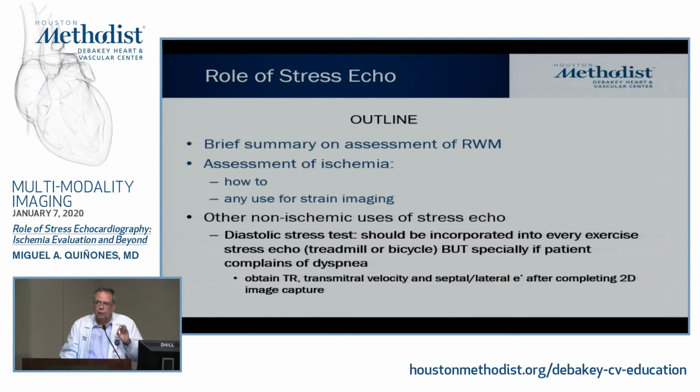There's no reason why any patient that gets a stress echo with exercise, not dobutamine, should not have, after finishing your imaging, an assessment of TR, transmitral velocity, and lateral septal E primes. It's there. It takes literally 2 minutes to get, and we can then assess, because it has very nicely been shown that the stunning phenomenon applies to diastole as well as systole.